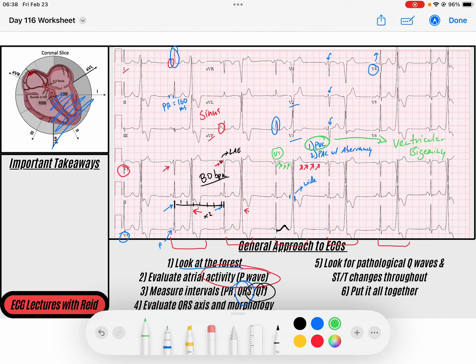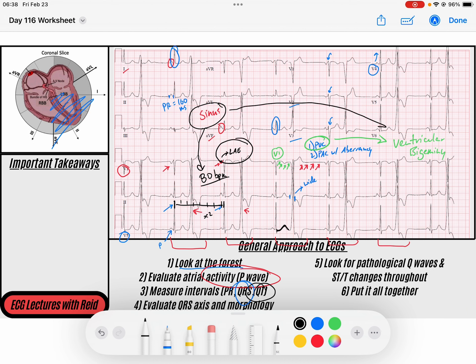Putting this all together: we have a sinus rhythm at roughly 80 beats per minute, left atrial enlargement, and premature ventricular contractions in a pattern of ventricular bigeminy.